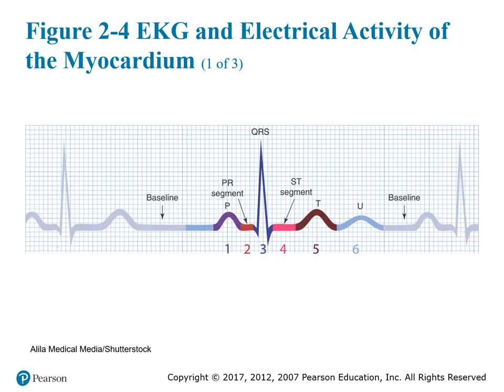So I'll show you. On this diagram, you see there's P, which signifies atrial depolarization, followed by your QRS, which signifies ventricular depolarization, then your T wave, which signifies ventricular repolarization, and there's your U wave, which signifies late ventricular repolarization, meaning it hasn't completely relaxed yet because it's pulsating at a slow beat. This is what we call your baseline, where all your rhythms pretty much sit. That is your baseline.